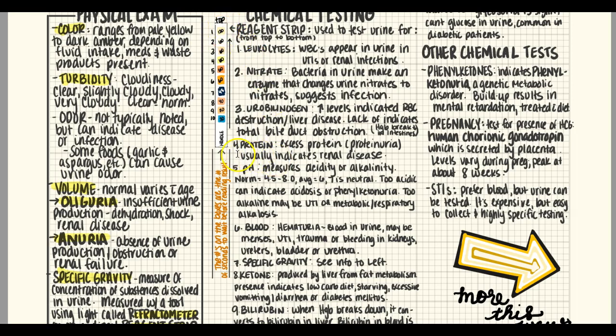So this is what I can tell you. Until you get used to doing these, you're going to start reading at 30 seconds, these two bottom ones, and then pretty much keep reading until it hits 2 minutes, because what happens is if you do not read these quickly enough, the colors will start to change and they won't match any of the boxes on the results chart.